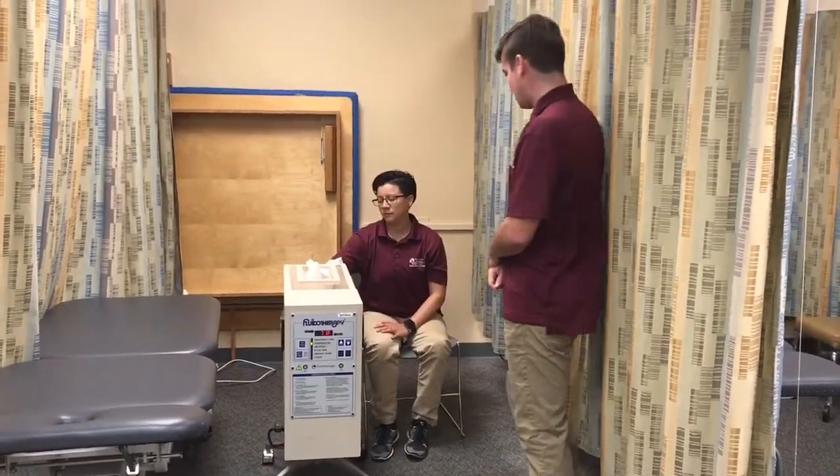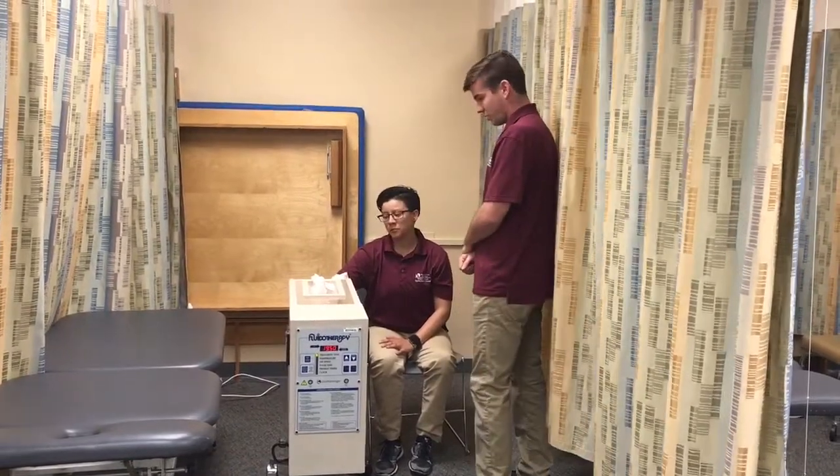So now it's been five minutes. How are you feeling? Too hot? Feels good? Okay, perfect.